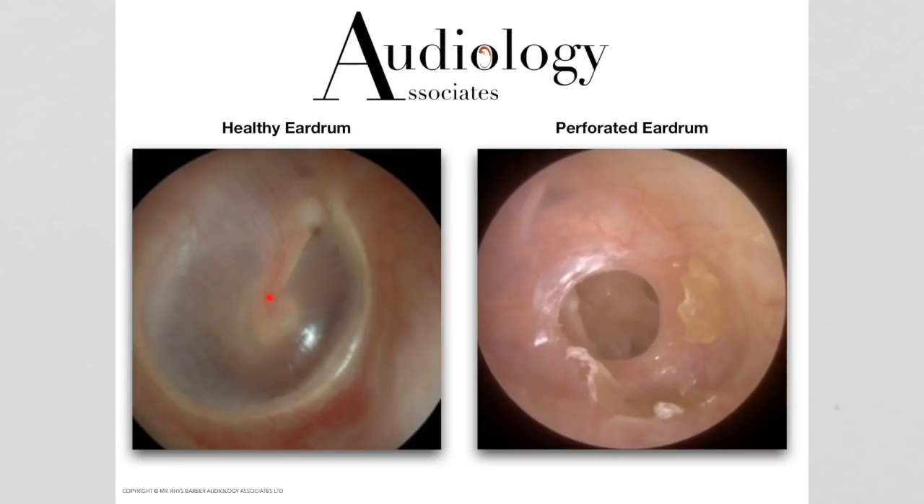We're going to look for the hammer bone, which is this section here just sitting behind the eardrum, protruding through ever so slightly. We're also going to be looking for what we call a light reflex. In most cases the light reflex will normally be what they call a cone of light — more this kind of shape — which is the sort of reflection you get back. If the eardrum isn't sitting quite in its normal position, you'll get a more diffuse looking light reflex. Basically this is the light from the endoscope shining back at us.